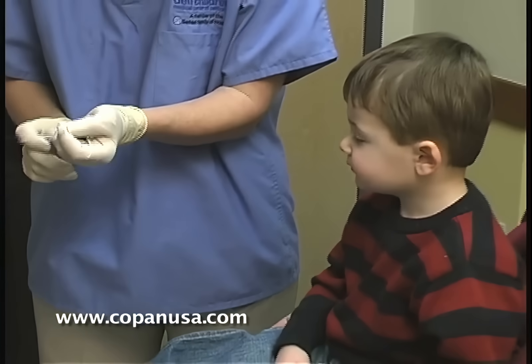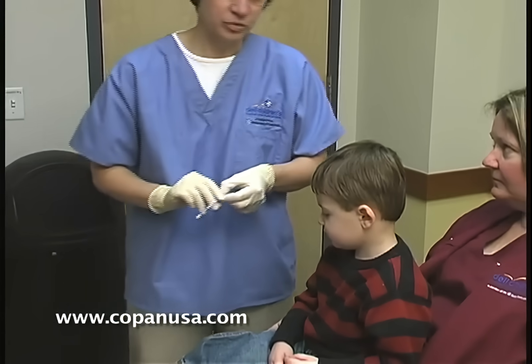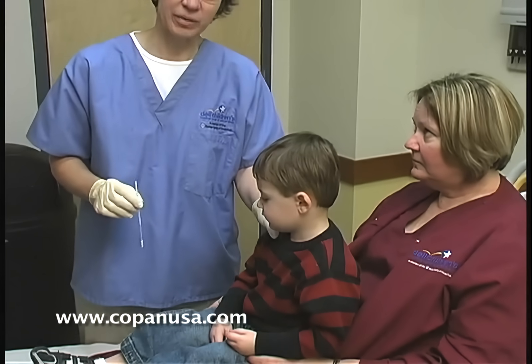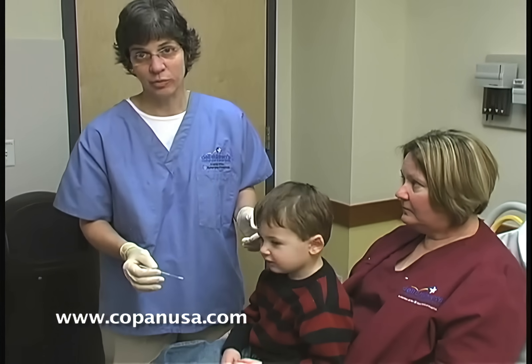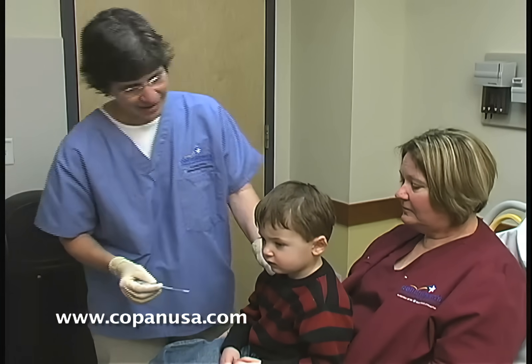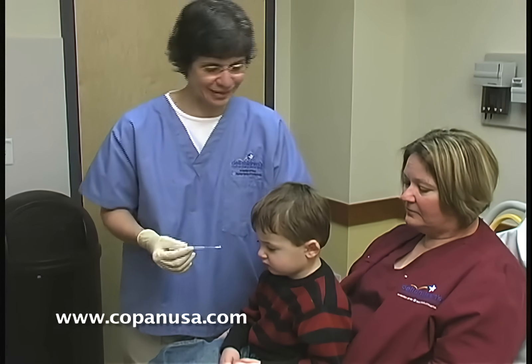When having the parent or guardian hold the child for this procedure, it's very important. The age of the kid matters a lot because babies are very easy to hold. As they get a little bigger, they certainly start to wiggle more, and as they get bigger than Rowling, they start to kick. So you want to protect not only the patient, but yourself when you're getting a sample.